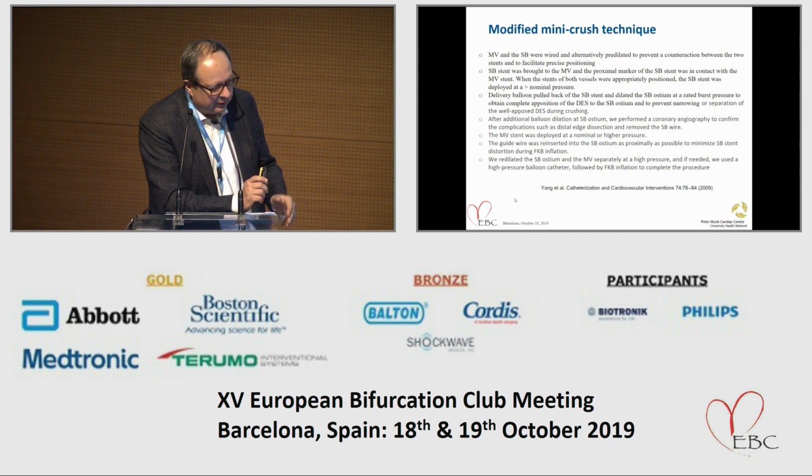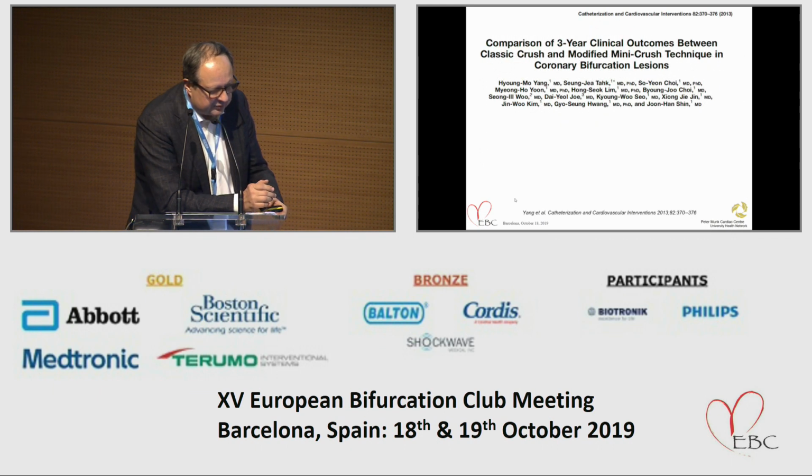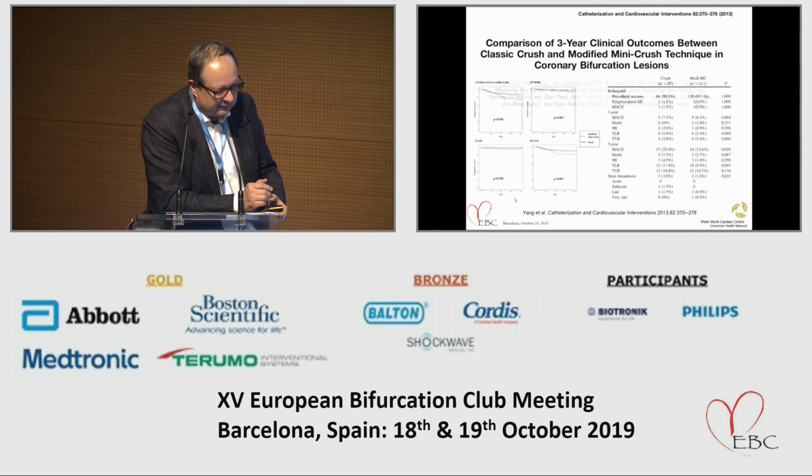You still have to recross, but in this particular study, in which they described their experience a few years later with the modified mini crush technique, they showed superb results compared to the standard crush. As you can see, at 3 years, MACE was 25% with classic crush versus half that, 12.6%, with the modified mini crush. Death rate is even considerably lower. So at 3 years, for complex lesions, these are really great results.